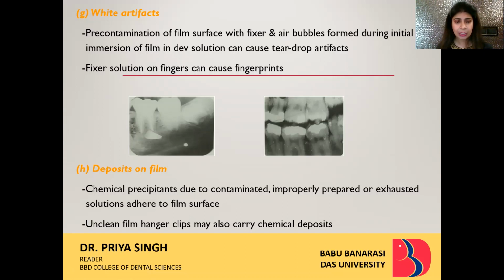Deposits on film. Chemical precipitation due to contaminated, improperly prepared or exhausted solution adheres to the film surface. So all these depositions on the film can also lead to an unclean surface, as you can see in this particular radiograph. And if it lies on the pathology, or on the normal anatomical region, it will be difficult for you to do interpretation.